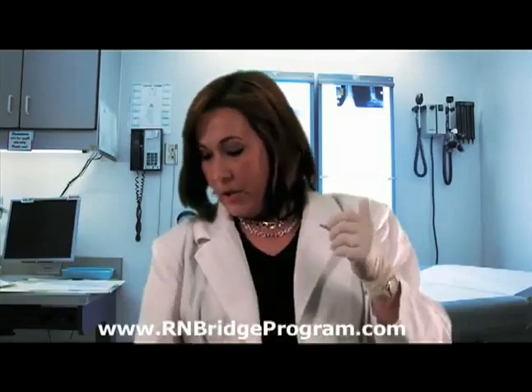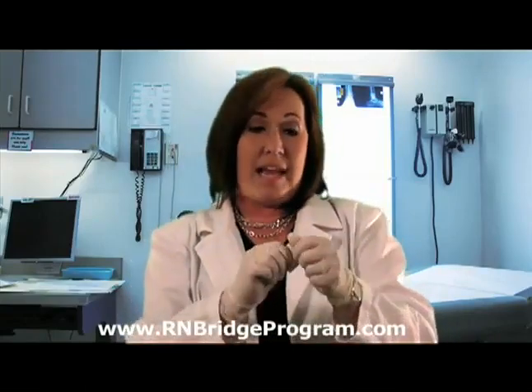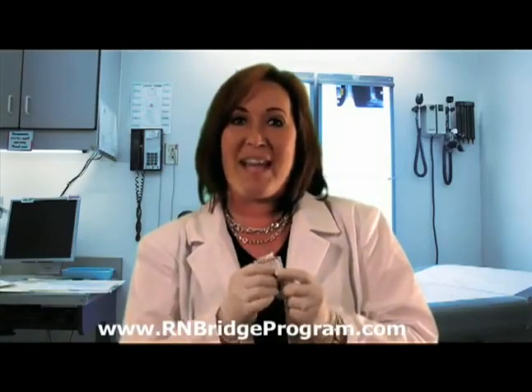And then once we get the gloves on, we're going to take the alcohol, because another part of asepsis is actually cleaning the site with alcohol. So now let's go down to our patient.